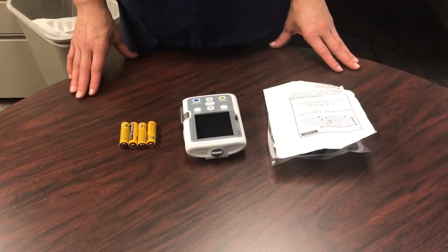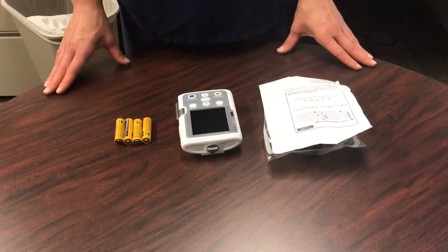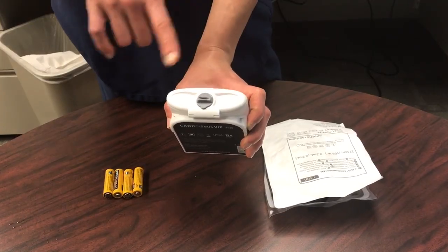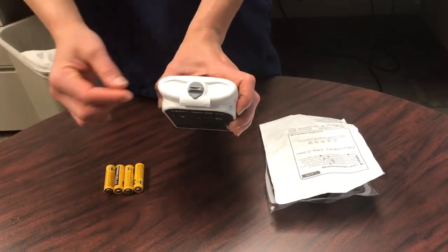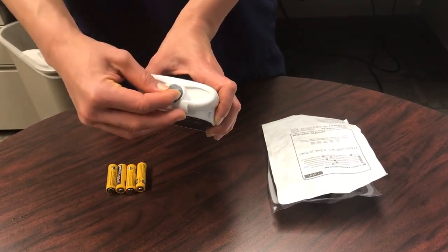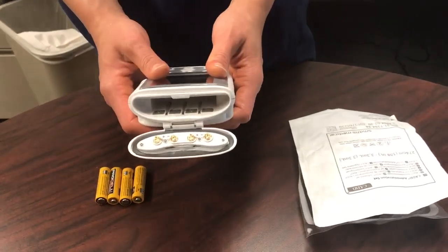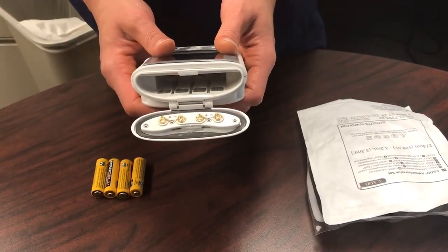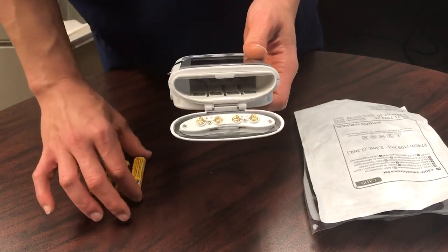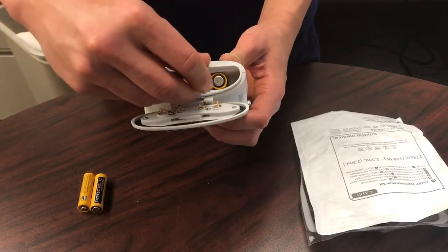The CADD-Solis pump is a battery-operated pump, so the first thing you want to do is load your batteries by opening the battery door found on the top of your pump, turn the knob, and go ahead and open it. The CADD-Solis pump requires four AA batteries, so go ahead and load those AA batteries into the pump.